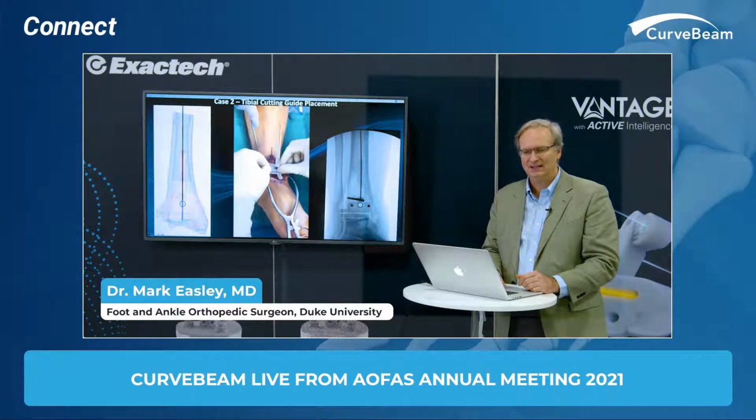Here's the planning stage that comes with the system. So I'll put that up next to my fluoroscopic view. You can see exactly matches what I've planned, and so I'm confident the cut block's in the right position.